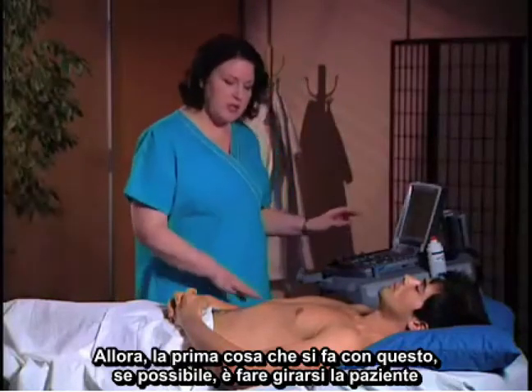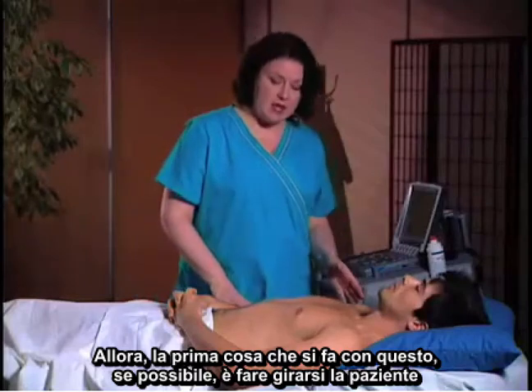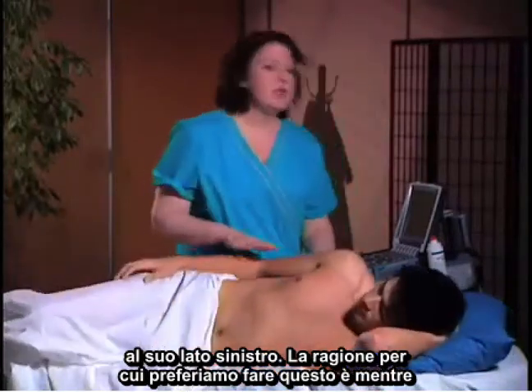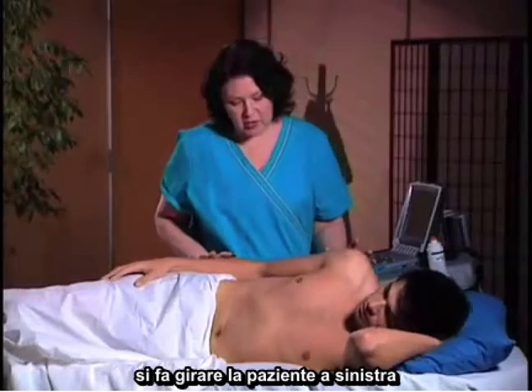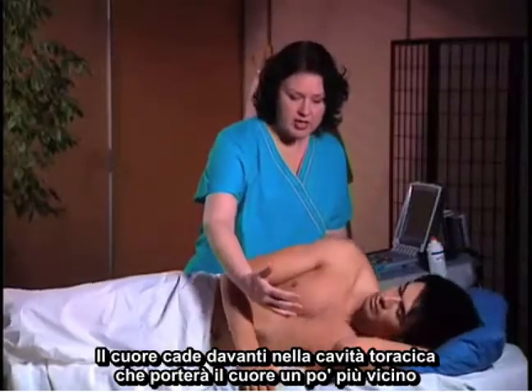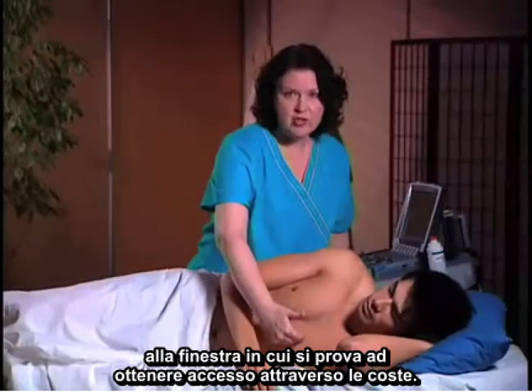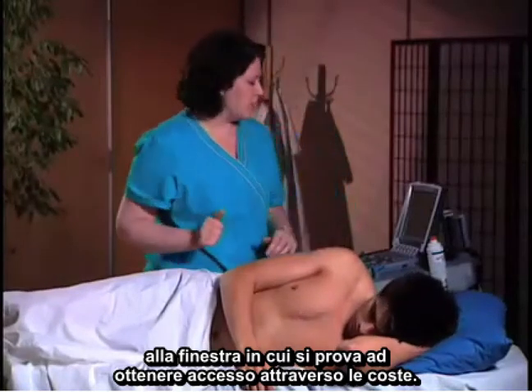The first thing you're going to do, if you can, is have the patient turn over to their left side. The reason we like to do this is as the patient turns to their left, the heart falls forward in the chest cavity and brings it a little bit closer to the window you're trying to access through the ribs.